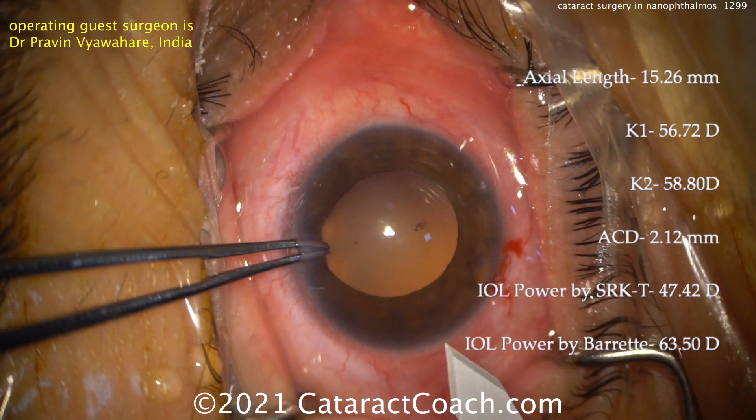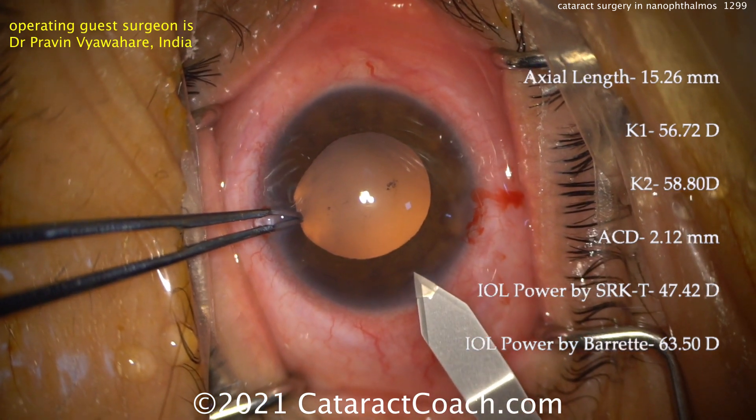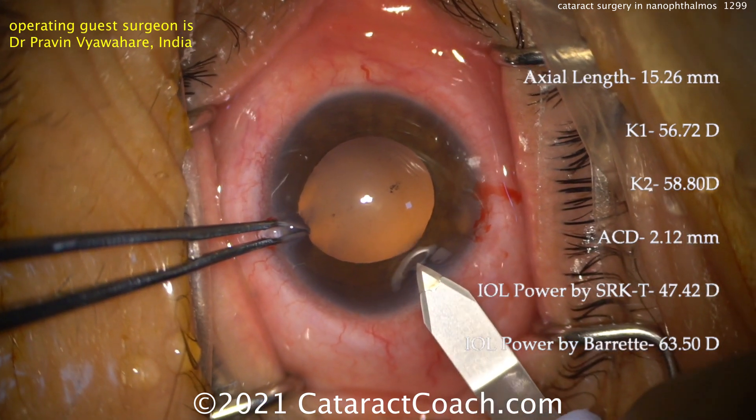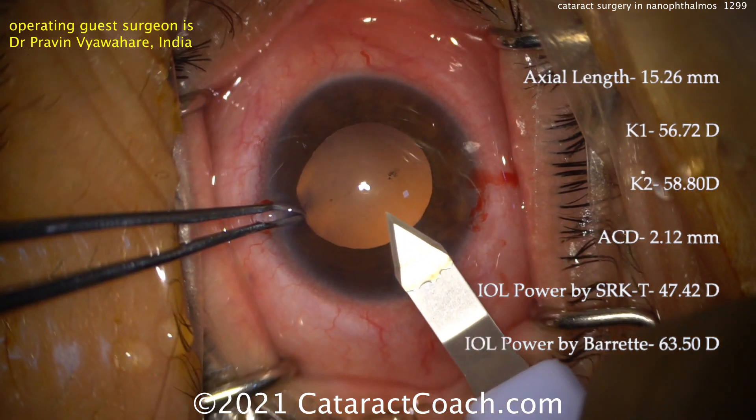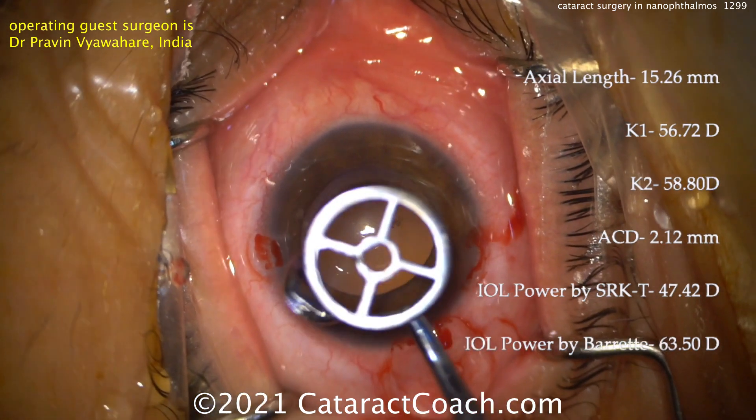In this case you're going to get iris prolapse very easily. Here comes the main incision — I like the positioning of it. They're right at the limbal vessels and entering the AC. Cleanly done. Now here's where you have to be very careful.